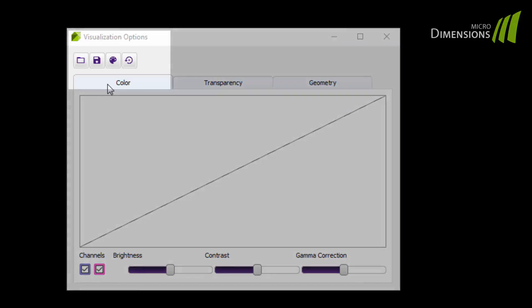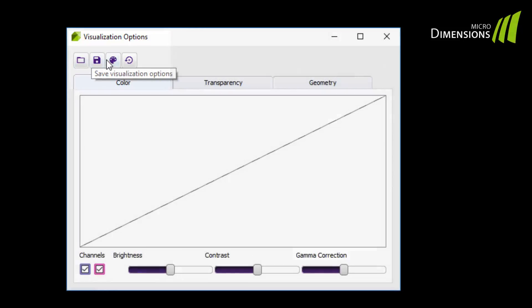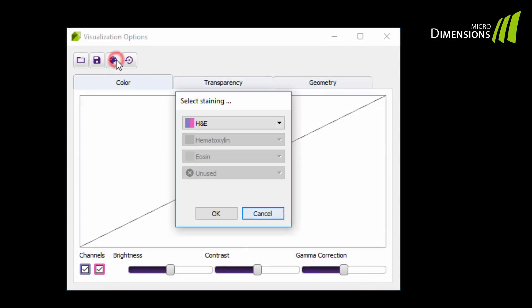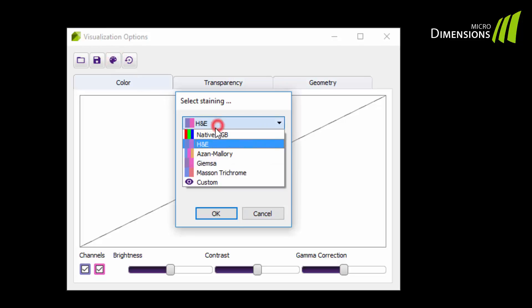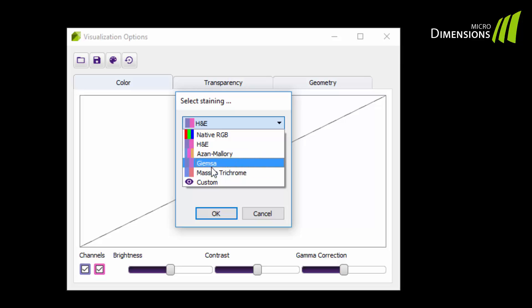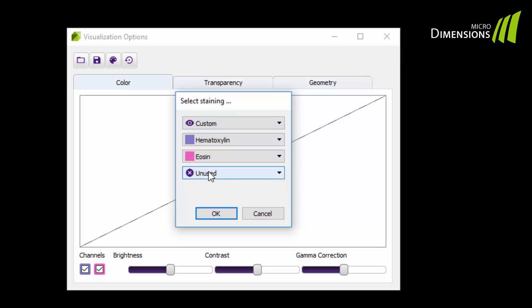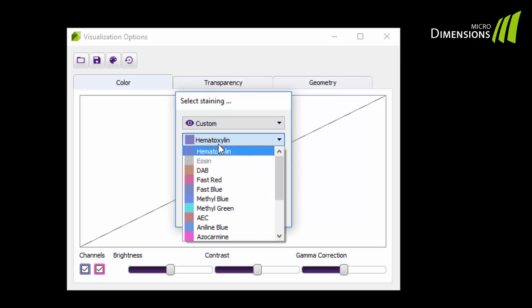With the buttons at the top of the editor you can load and save visualization options that you have previously defined. You can also set predefined color and transparency options like native RGB and several commonly used stains such as hematoxylin and eosin. Many more dyes can be combined individually in the custom mode.